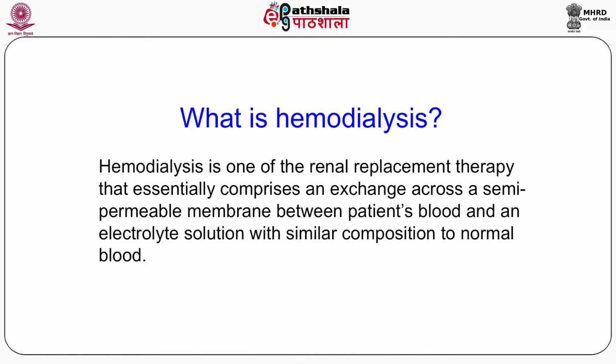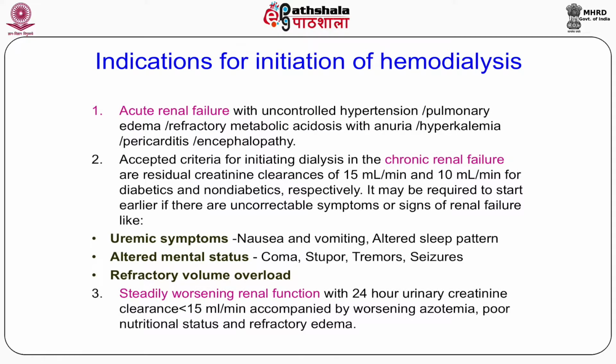Hemodialysis basically involves a process of exchange of waste products and electrolytes across a semi-permeable membrane between the patient's blood and an artificial electrolyte solution which is synthesized with a similar composition to normal extracellular fluid. So, in whom do you initiate the process of hemodialysis?